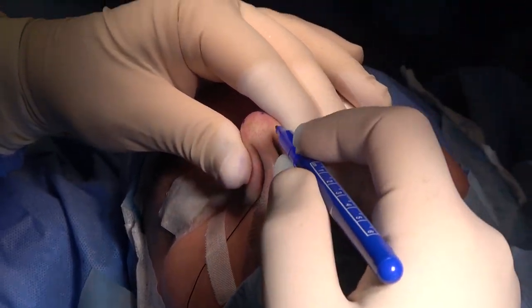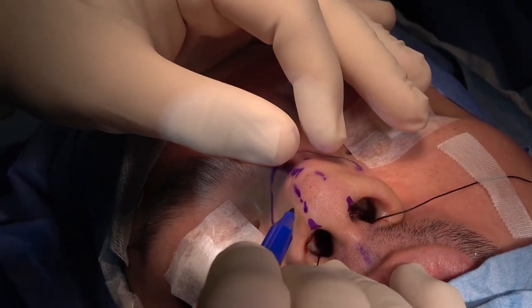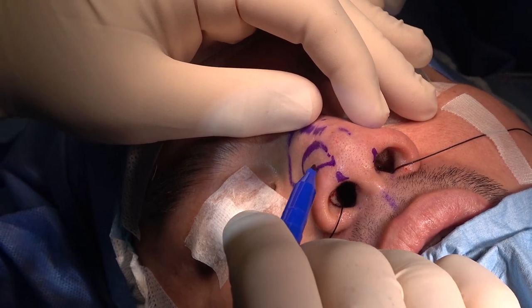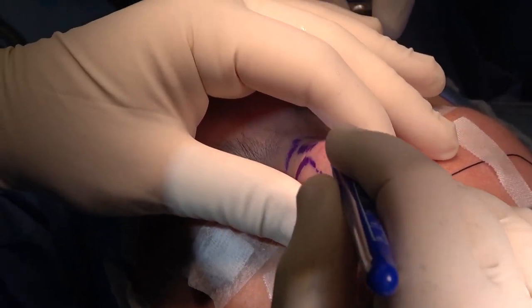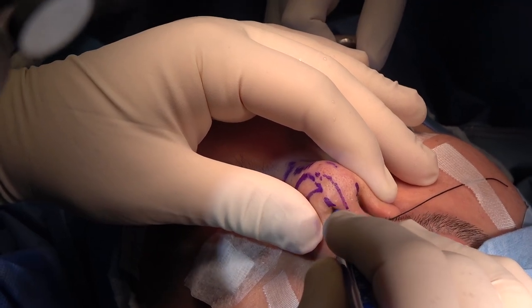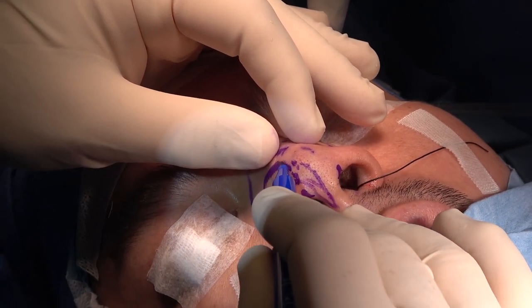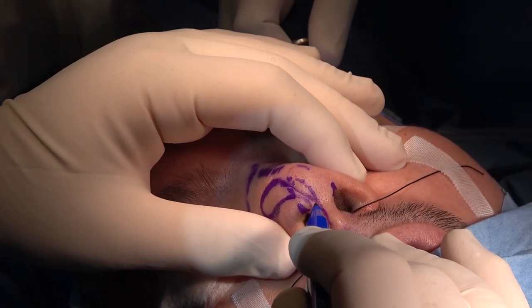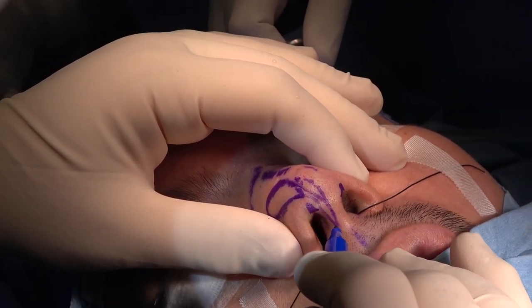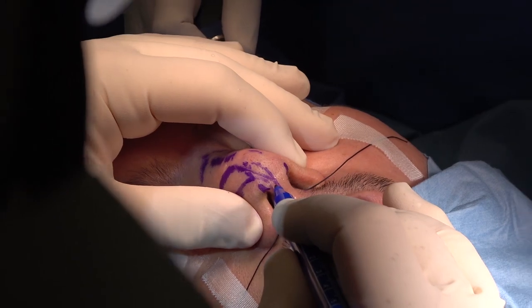Okay, we start first identifying the tip defining point, the junction between the intermediate crura and the lateral crus. As we do usually, we leave the lateral crus alone. No marginal incision, no exposure, no delivery. We'll be working mainly in the midline on the intermediate crus and on the upper portion of the medial crura. So we'll be leaving all this part of the alar cartilage intact, the caudal portion of the intermediate crura and the lateral crus. All this arch will stay intact.